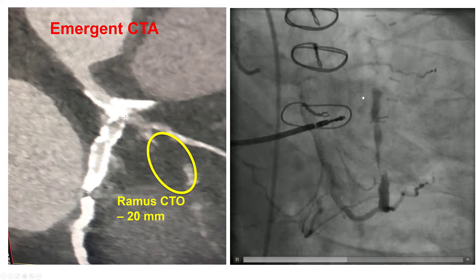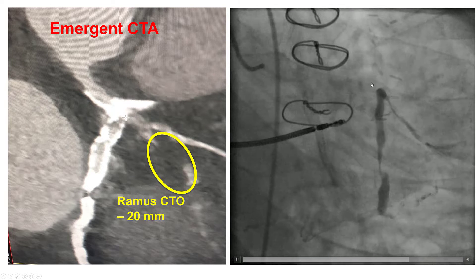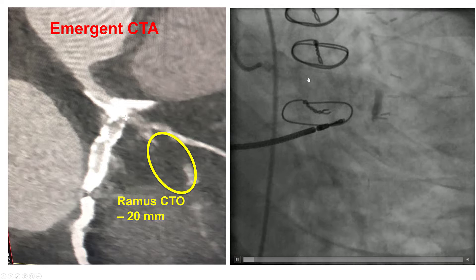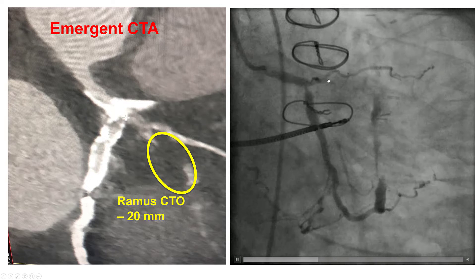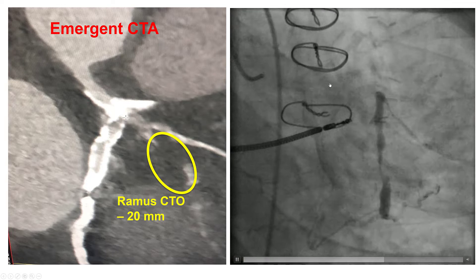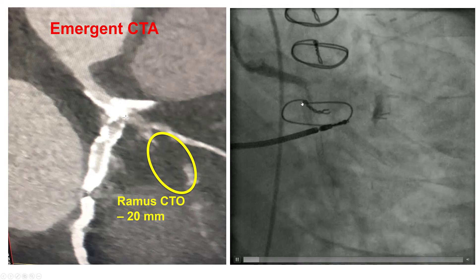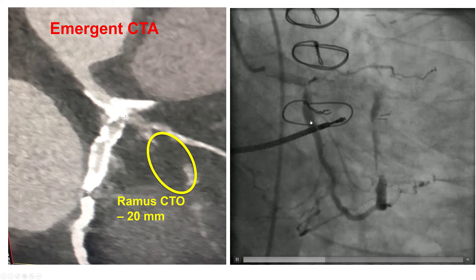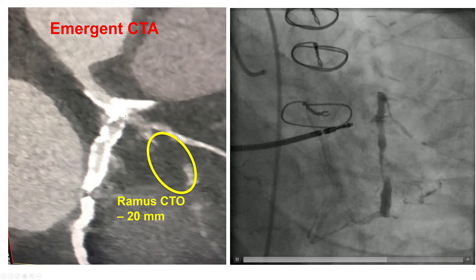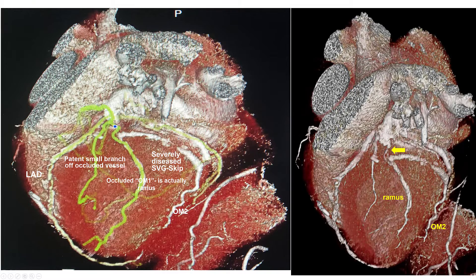So actually, this is not the 1st obtuse marginal branch, but instead this is the continuation of the RAMUS, which now has a nice tapered entry. This is a much easier lesion to treat than an unknown CTO of the circumflex. This can be seen better in the 3D reconstructions — this is the RAMUS, this is the CTO, this is the continuation of the RAMUS, and this is the 2nd obtuse marginal branch with a connecting SVG segment that has a severe lesion.